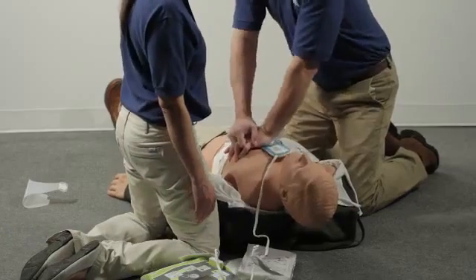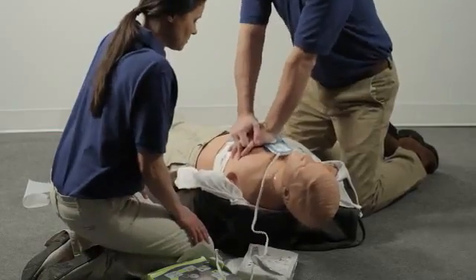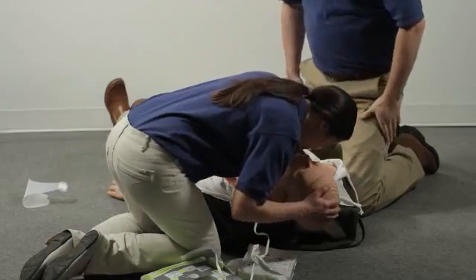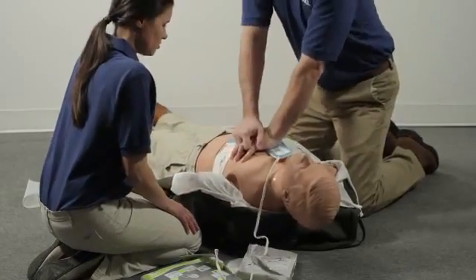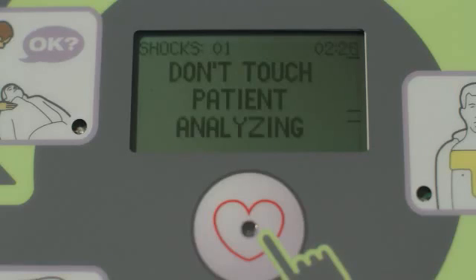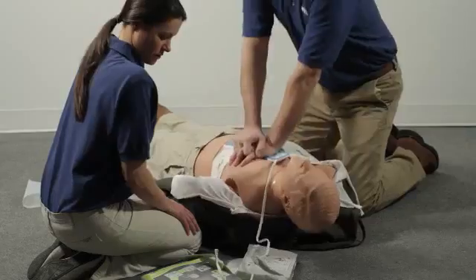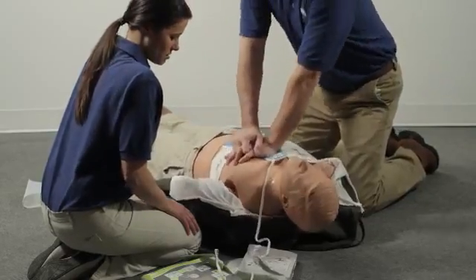Do 5 full cycles of compressing the chest 30 times and breathing 2 times. Continue to follow the AED prompts. If the AED tells you it is analyzing, do not touch the person. If the AED tells you a shock is needed, be sure no one is touching the person before you press the shock button. Continue to follow the prompts and provide CPR until help arrives or the person wakes up.